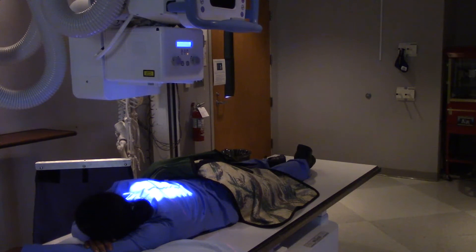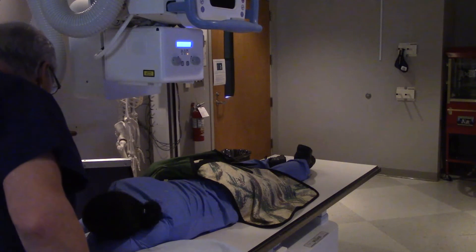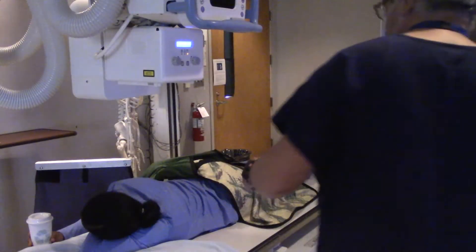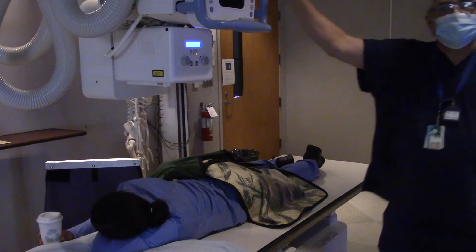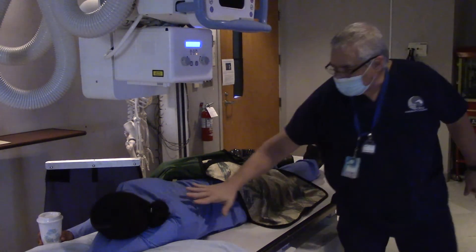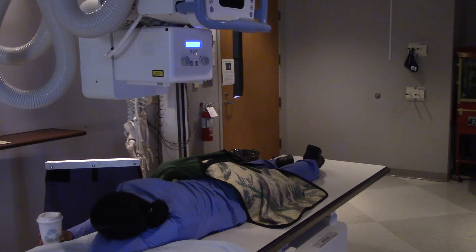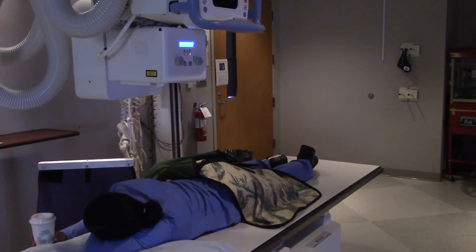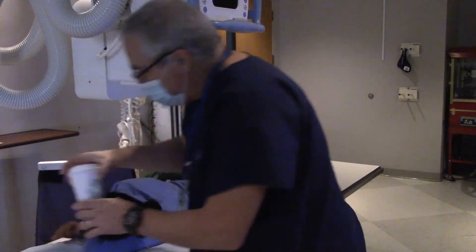All right ma'am, I'm going to give you your cup of barium once again. I promise this is the last time I'm going to make you drink this stuff — I know you're probably getting tired of it. By some miracle, my tube is still in detent after all that messing around, so I think we're set. All right ma'am, if you would, just start drinking. Hold still and drink — beep! Okay, you can relax and breathe normally. All right, let me take that barium away from you.